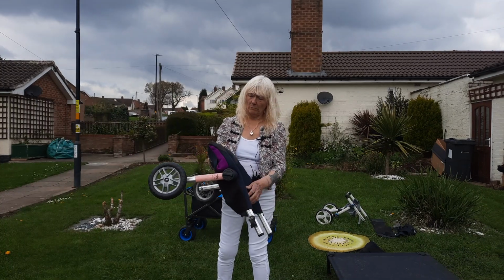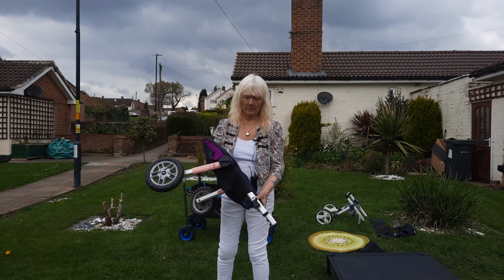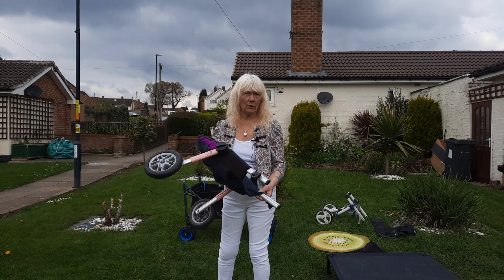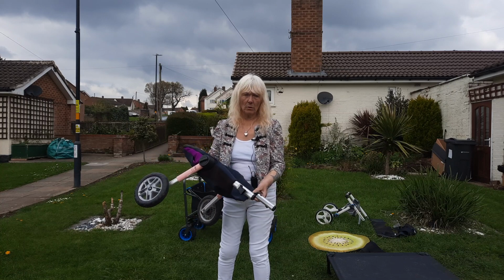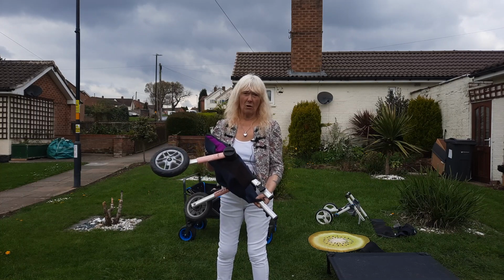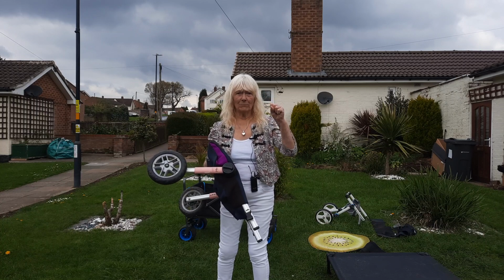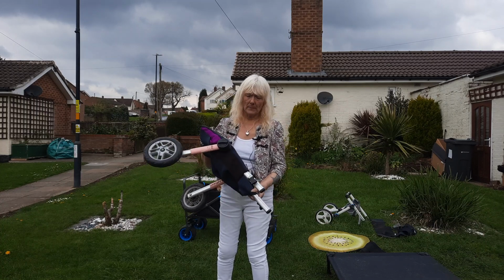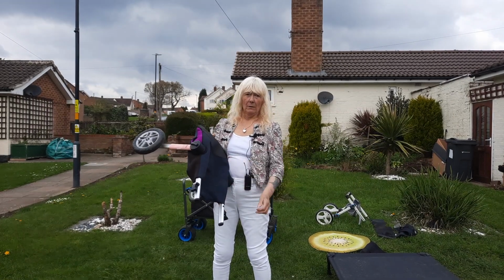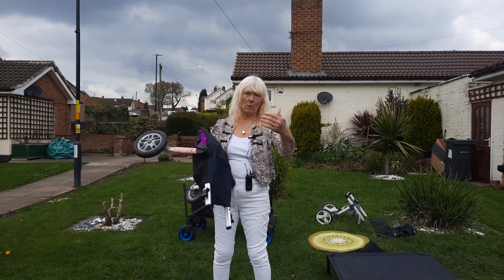Might look a bit odd because I haven't actually, I just put it on there for her. But I'm thinking about actually making a prototype, because there must be quite a few dogs out there, double amputees, who are uncomfortably bobbing around on those two rings. And believe me, they can't be that comfortable because there's a big lycra in the middle that keeps the two rings together. Well, they're sitting on that. So anybody watching, if you've got a double amputee dog, you can use this. It's called neoprene, or you can buy the material and design it to whatever you want.